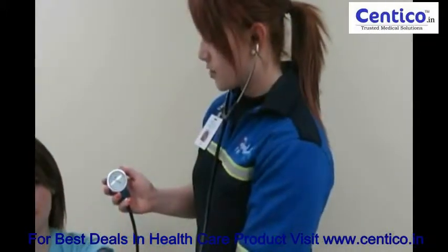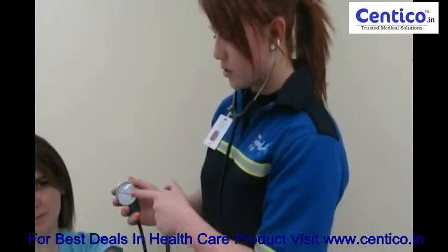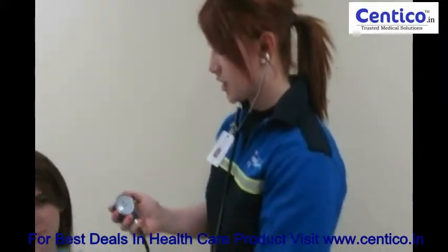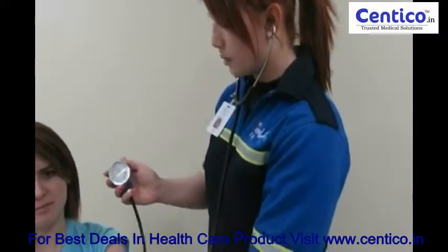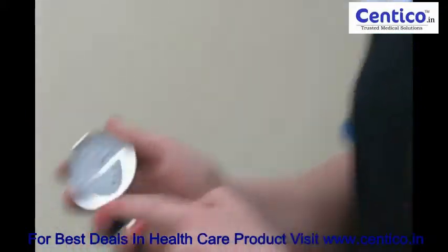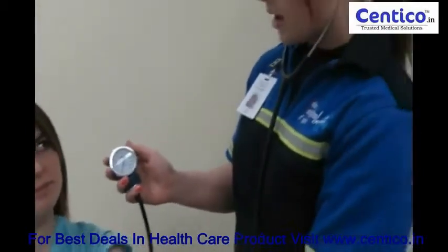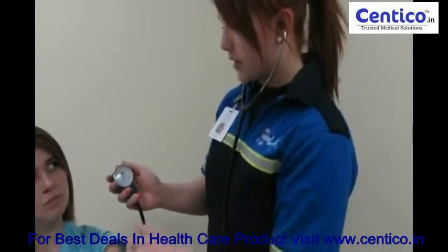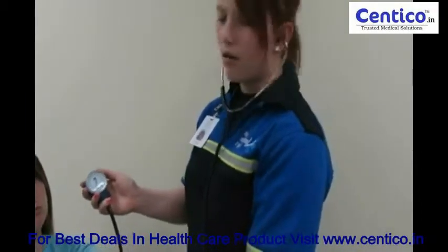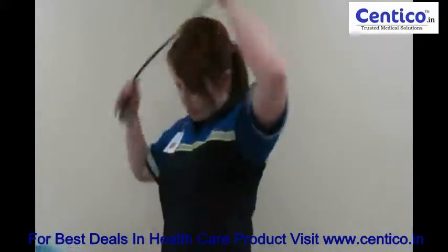Now, when I hear the first pulse, I have to take the measure on the dial, and it will give me the systolic pressure. And after, when the pulse stops, I have to take the measure on the dial again, and it will give me the diastolic pressure. For example, it can be 110 over 76 mm of mercury. And after, I only have to compare it with a normal pressure.